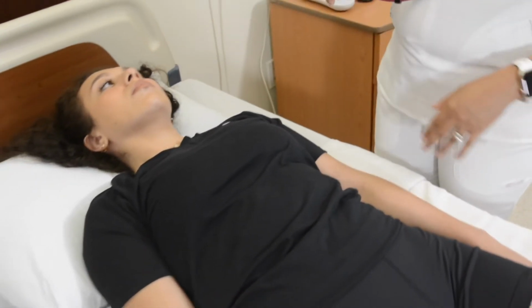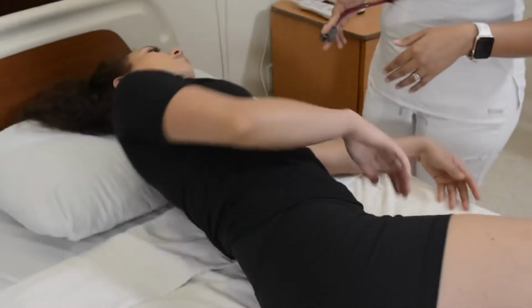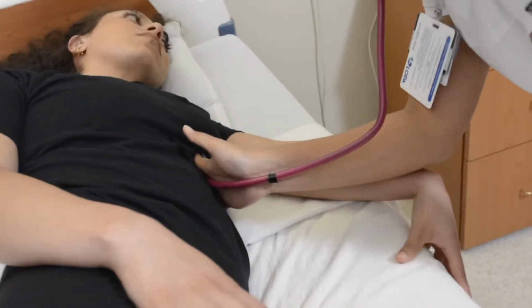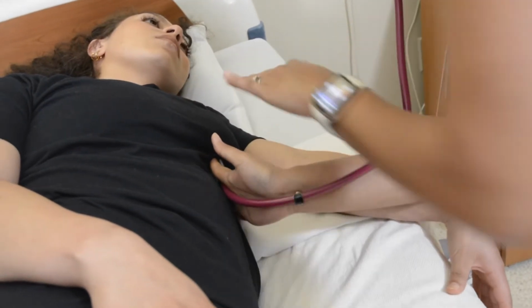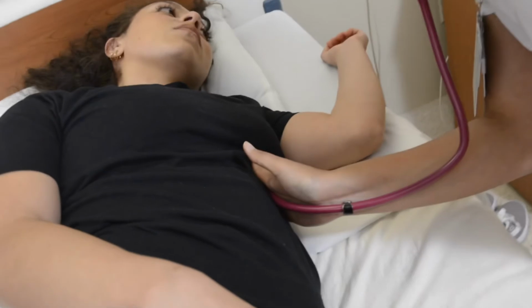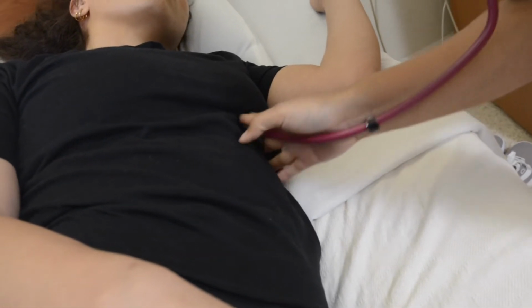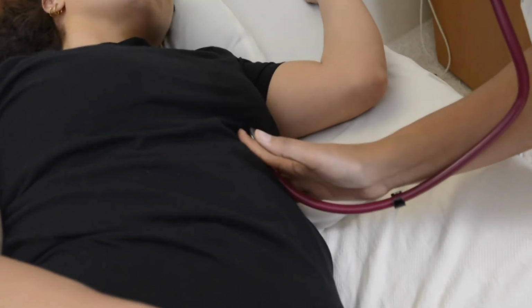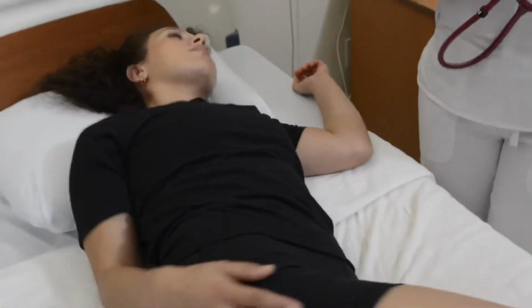Now, I'm just going to need you to lie on your left side, in this way. Here we go, like I said before, mid-clavicular, fifth intercostal space, and I'm just listening to your mitral area. It's different because you're lying on your left side. Very good. You can go back on your back.